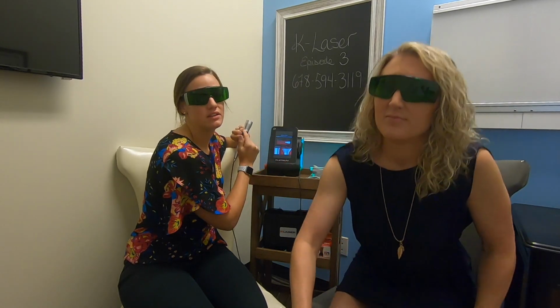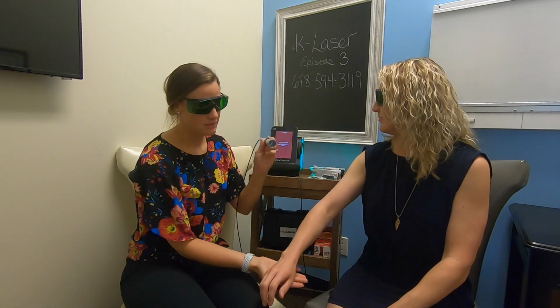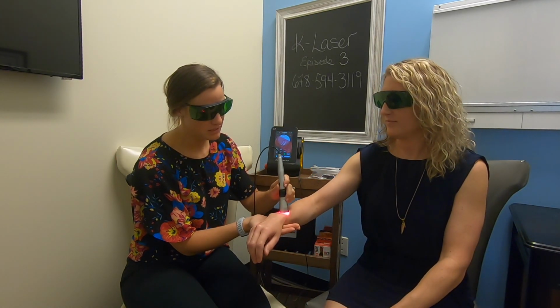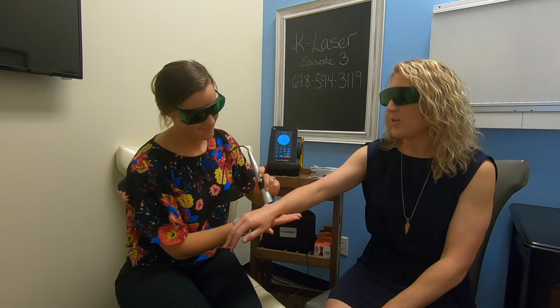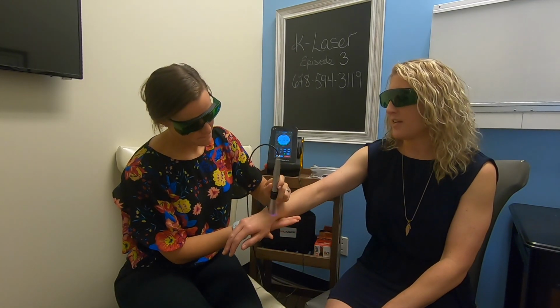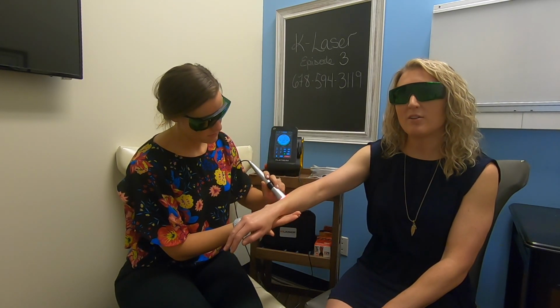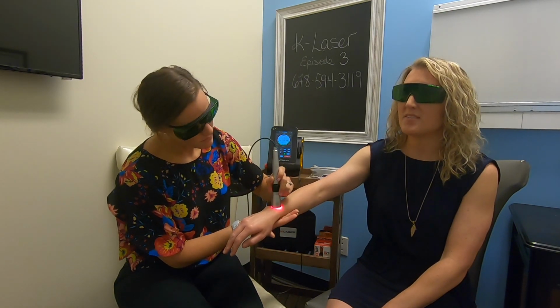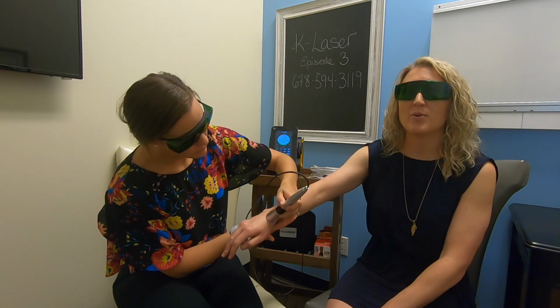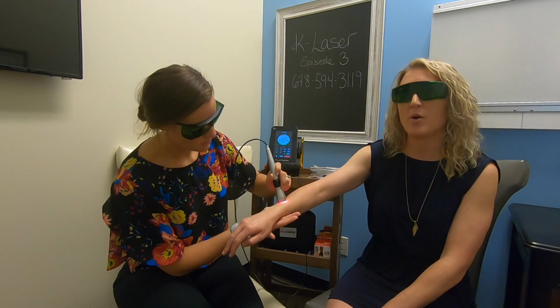We choose our laser head, which we've already determined, and we simply just place it on there, and it starts going. All right. With this laser, you actually have to keep it moving continuously, otherwise it can burn you because of how strong it is. With a lower level laser, you can keep it in place because it only really goes through the skin. This goes through skin, fat, muscle, tendon, bone, so it has much more potency.